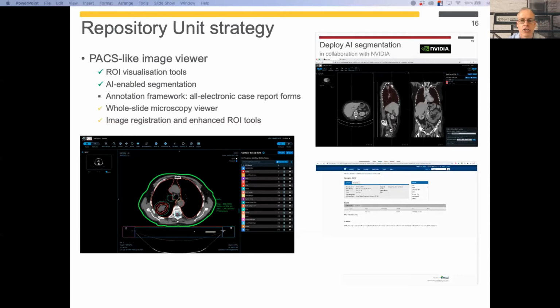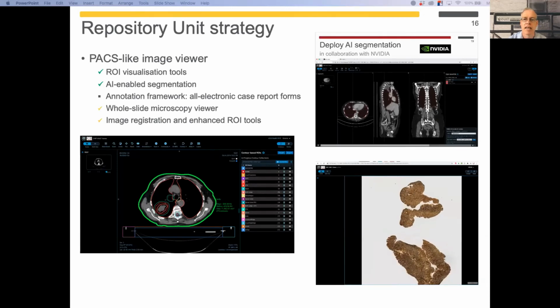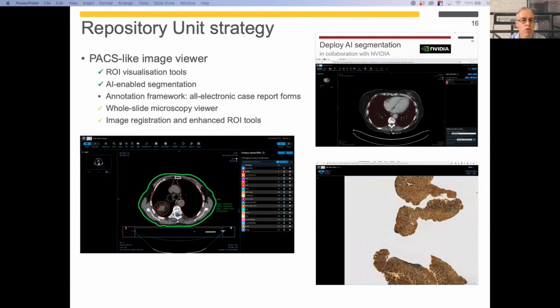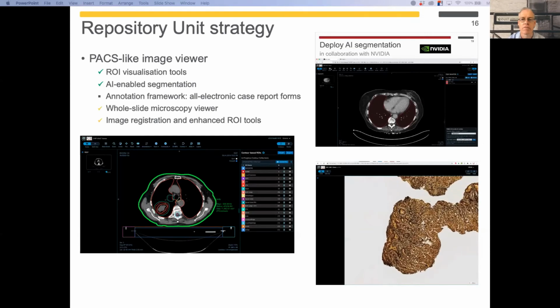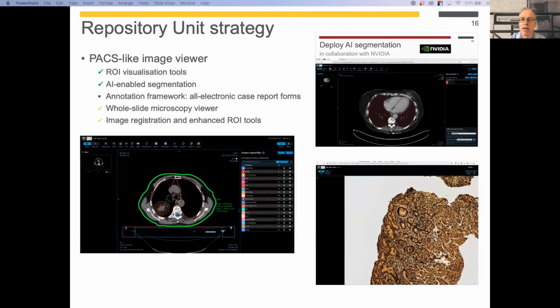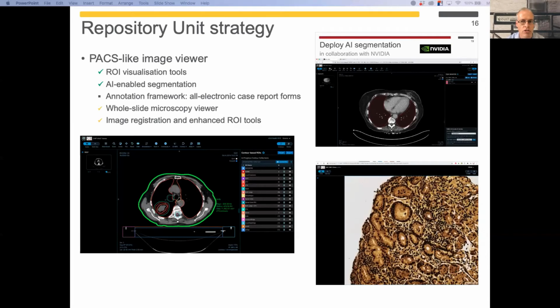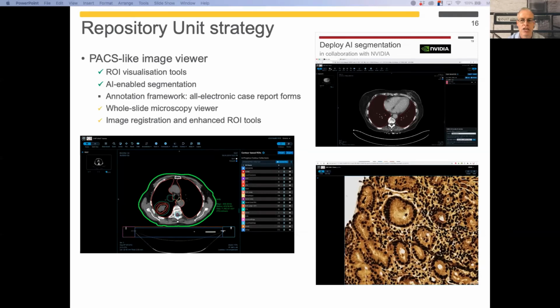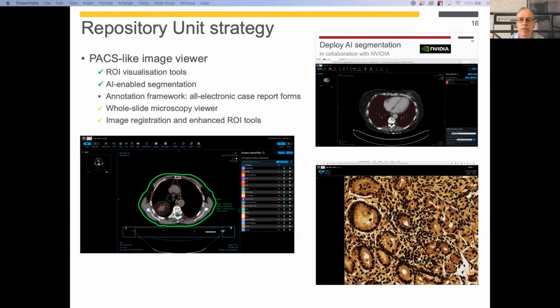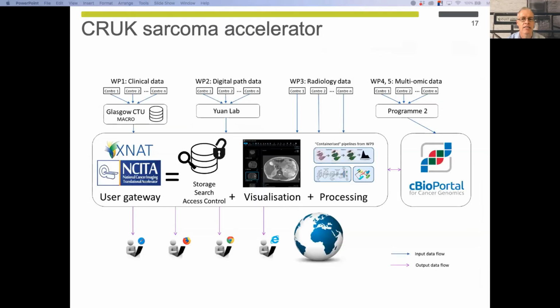Now, coming back to the question on digital pathology, we're really excited that DICOM Web will soon be available to XNAT. It's been great to work on the pre-release version with Dan's team. What you're now seeing is a sneak preview of one of the early wins from this. Sharp-eyed observers of the XNAT discussion forum will have noticed that we've now enabled DICOM GM and SM IODs as session types in XNAT, and we're currently on an alpha build of our new integration of the whole slide viewer with XNAT. And you'll have seen how we can just click through from one of those new XNAT session pages to interact with the microscopy data in a way that should be completely intuitive. And this will once again extend the range of data types that we can work with in XNAT.